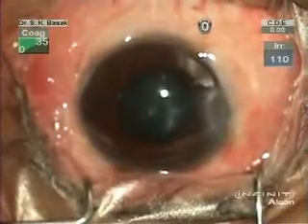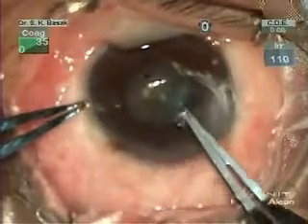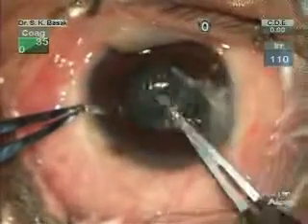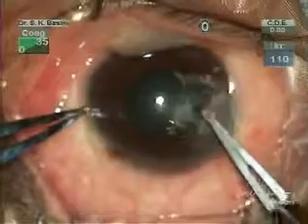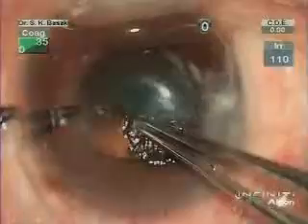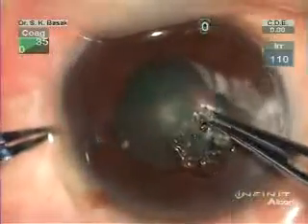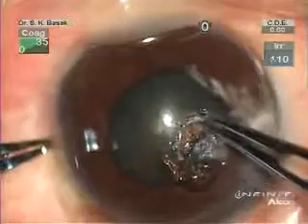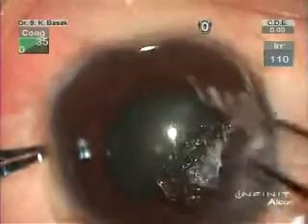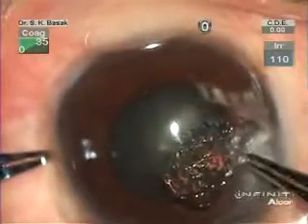Under topical or peribulbar block, with the help of forceps, the cleavage plane was identified. And then the nodule was resected with fine tooth forceps, just peeling off the diseased area.